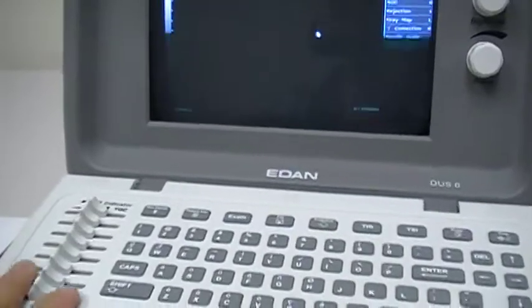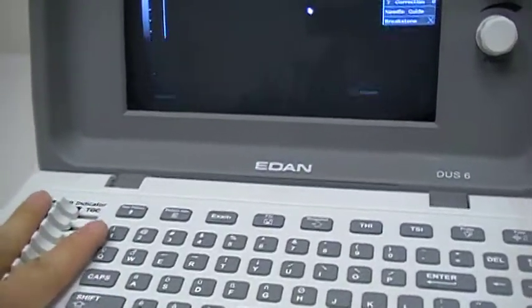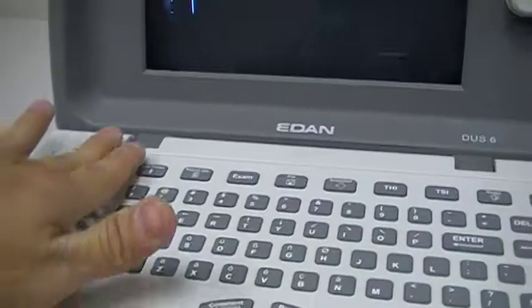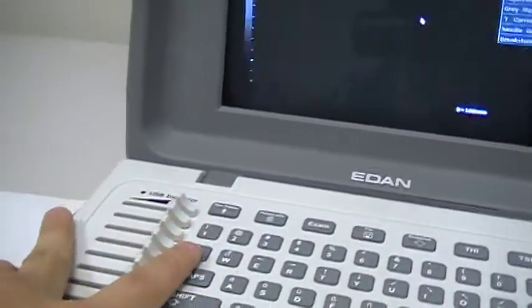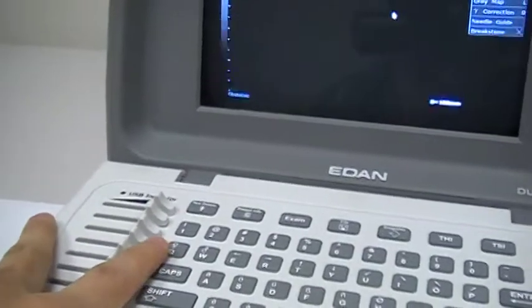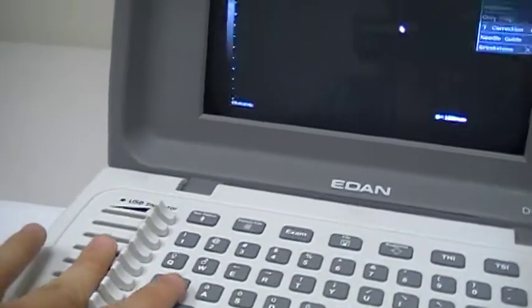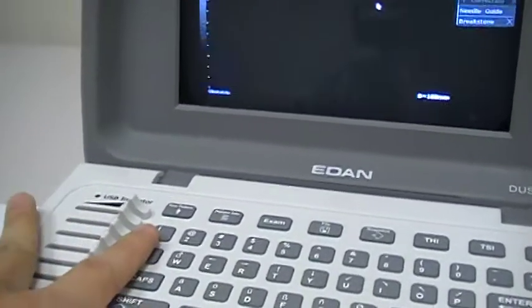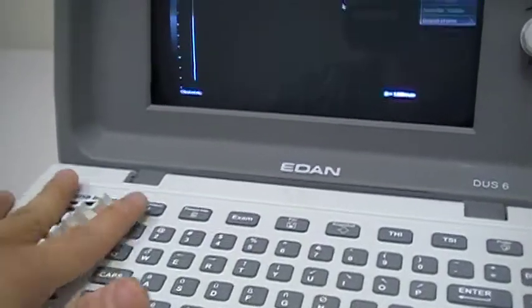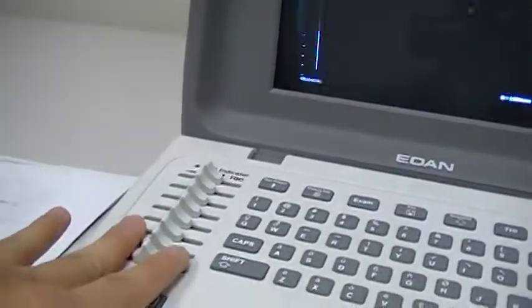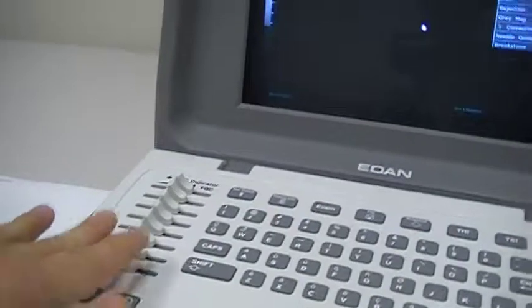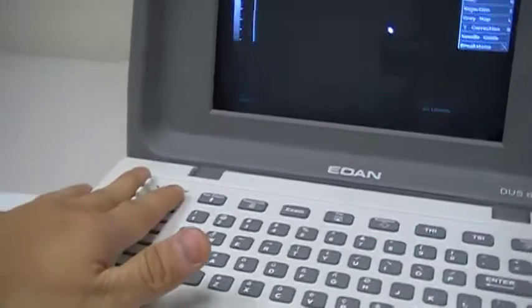Before we start to scan an image, we put the TGC in the middle position. We don't put it at the maximum position because that's not good for the machine, and we may not need to use such a high setting. Putting it in the middle should be enough, so we just set it there.